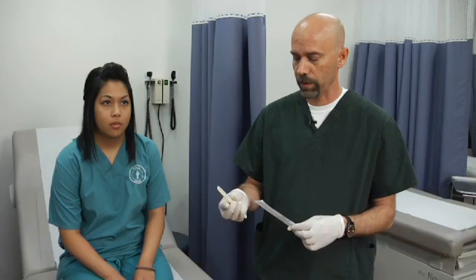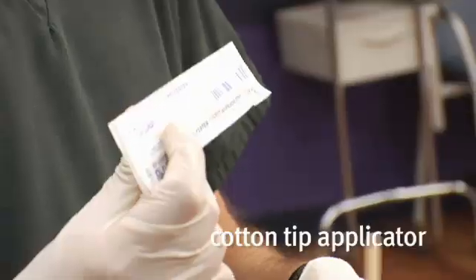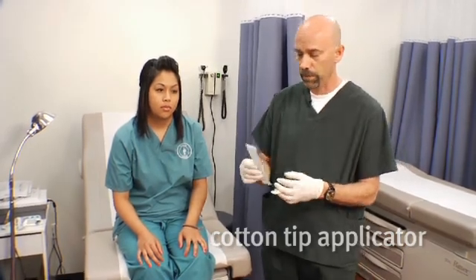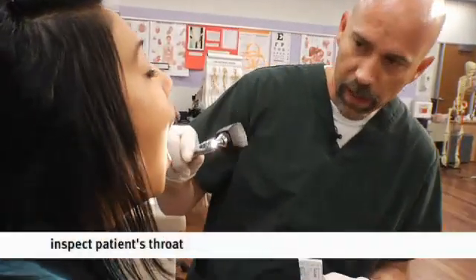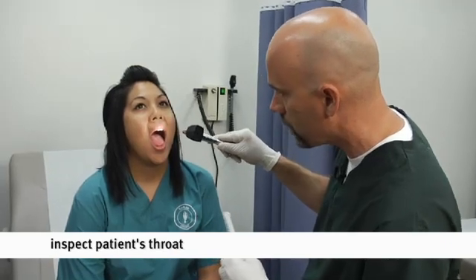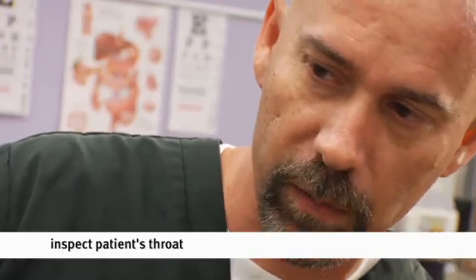A couple of things that we're going to need is, one, a tongue depressor. And we're also going to need a rayon-tipped, cotton tip applicator to collect a sample from the back of the patient's throat. Okay? First thing we're going to do is look at the patient's throat. Have the patient open up and say, ah. What that does is give us an idea of what we're working with, also an idea of where the infection might be.